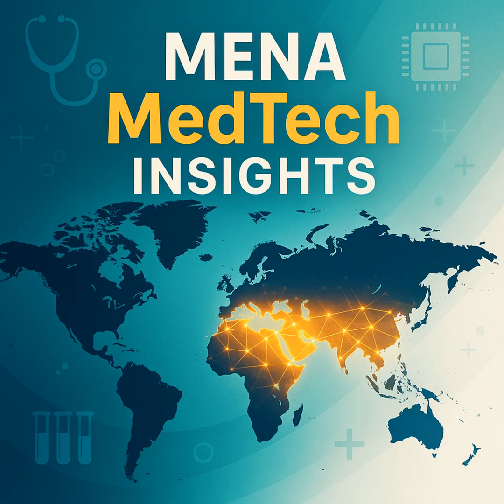The SFDA aligns its SaMD regulations closely with the guidelines from the International Medical Device Regulators Forum, or IMDRF. This involves a risk-based classification system, sorting SaMD into 4 categories, from Class A for the lowest risk to Class D for the highest. For instance, a simple app that monitors general wellness might be Class A.